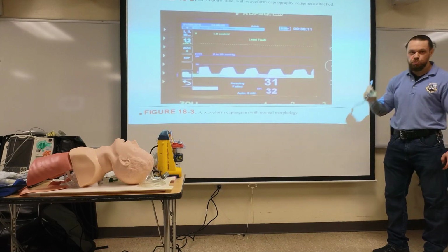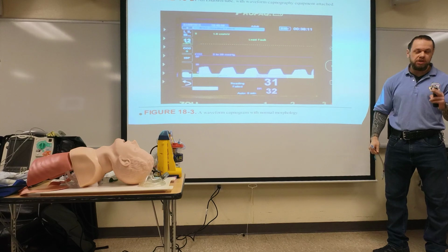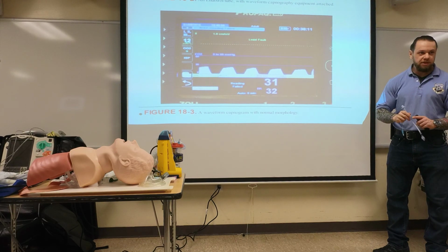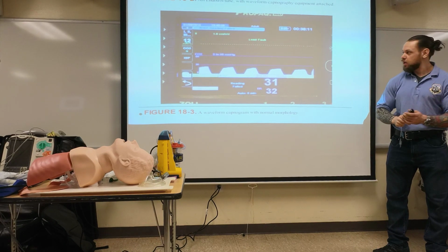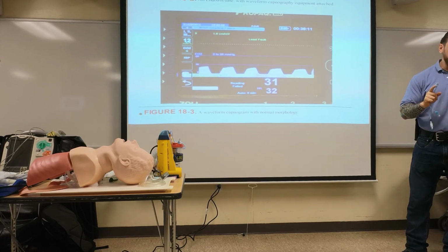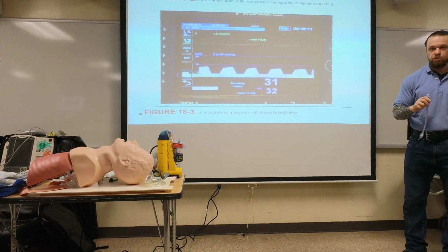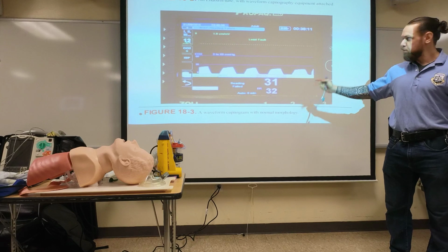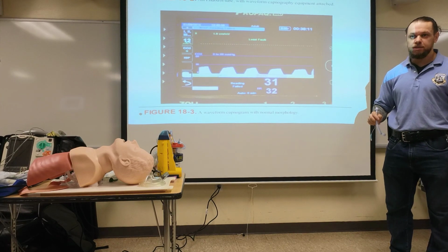And then, once the tube is in, I'm going to talk about the confirmation that we're going to do. There's two that you're going to need. I don't want to hear misting, bubbling, something like that. Confirmation number one, you have waveform capnography. This is numbers: 35 to 45. More importantly, you want to have objective data. I print a strip, I know my tube was in if I have 35 to 45. The next thing I want to do is get lung sounds.